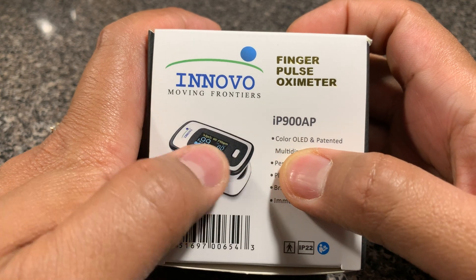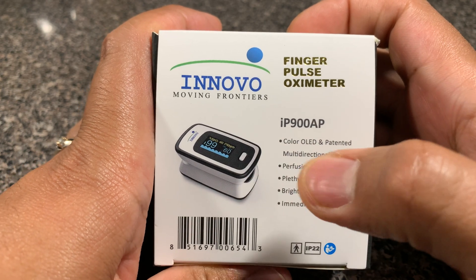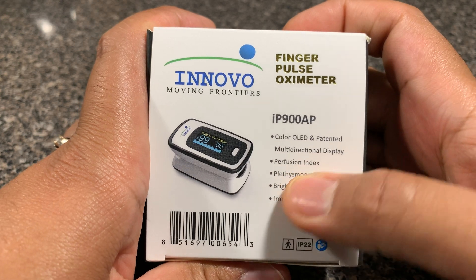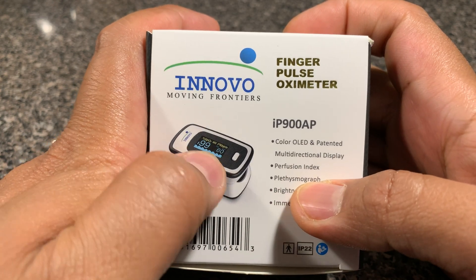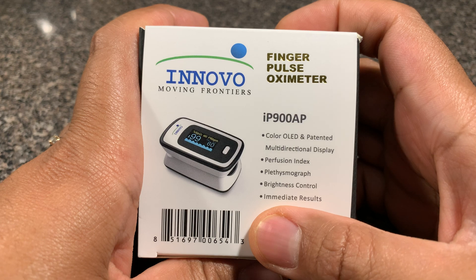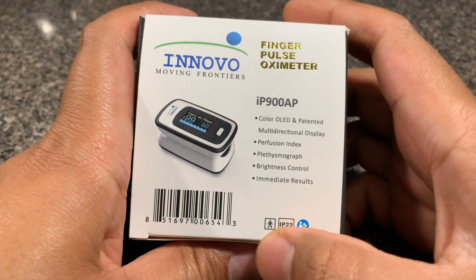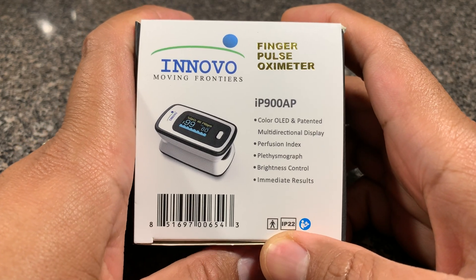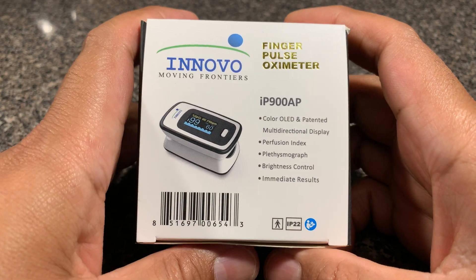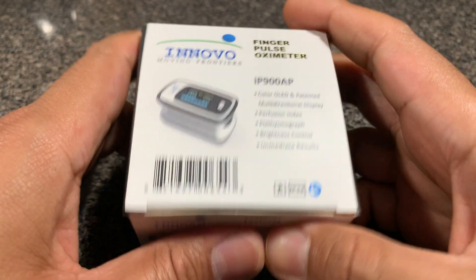This features a color OLED display, and a patented multidirectional display — so you can change the orientation, which I'll show you once I open the product. There's also a perfusion index and plethysmograph, which is the blue wave graphic you see at the bottom. Brightness control can be altered on this unit, and feedback is given in seconds — so that's immediate results. At the bottom, you'll notice it says IP22, which basically means it's safe for finger touch; as light is passed through your finger, it's not going to give you an electrical shock.